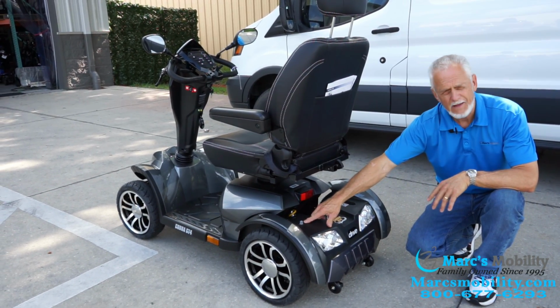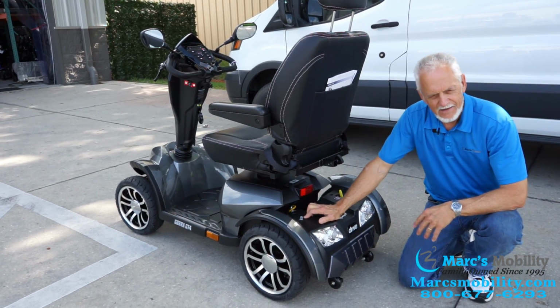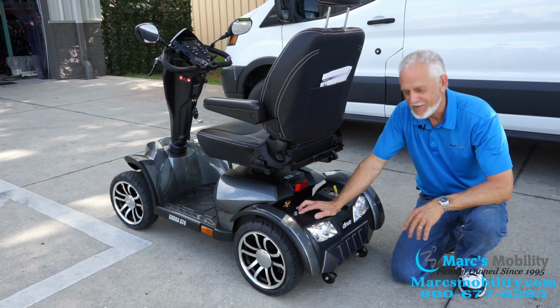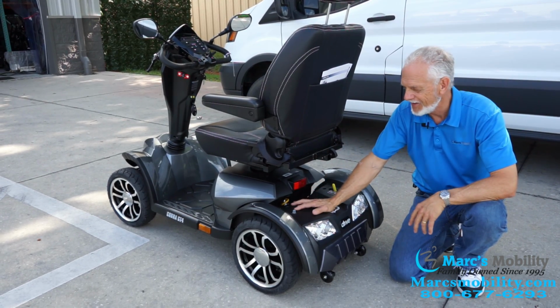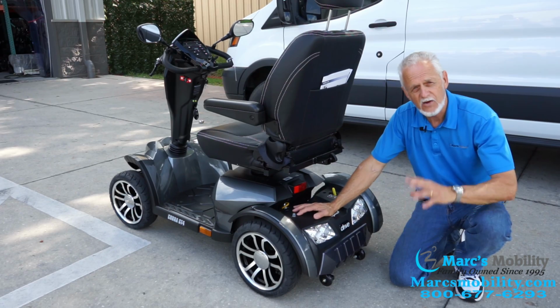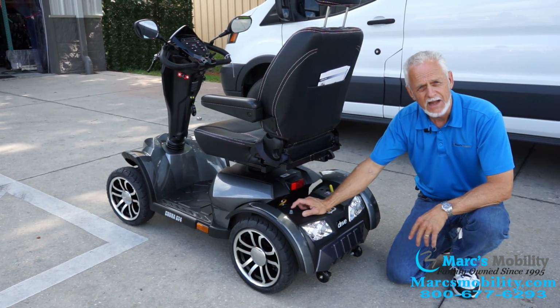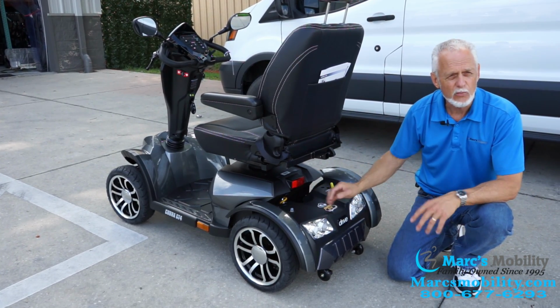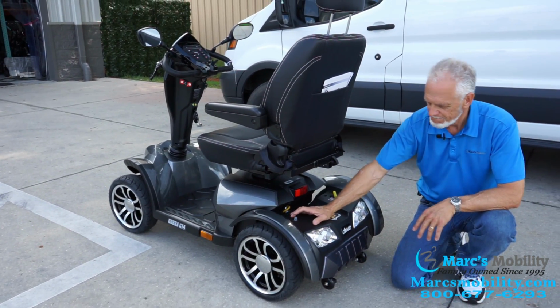Right here is your reset button. The reason you have a reset button is that some of you out there are extreme drivers. So if you get stuck somewhere where you shouldn't have been stuck and you're trying to get unstuck, like in the grass where it's really deep and muddy, instead of burning your motor, this reset will pop up. And a few minutes later, when it's cooled down, you can push it back down and then you're ready to go again. So this is just to keep you from burning your motor, the reset button right there.